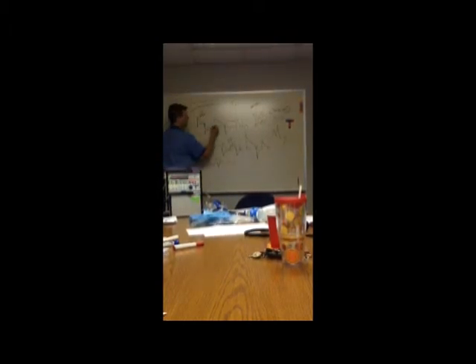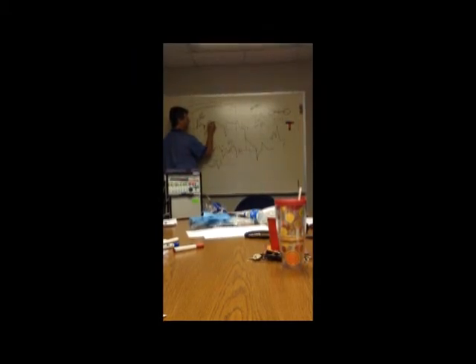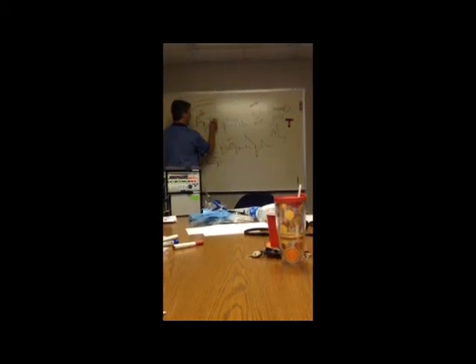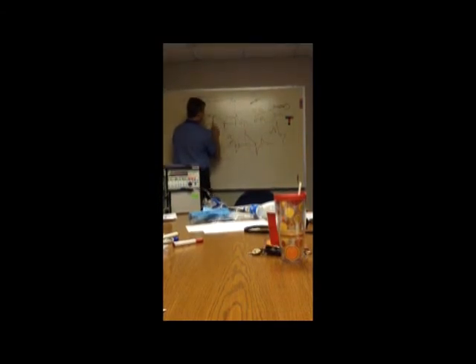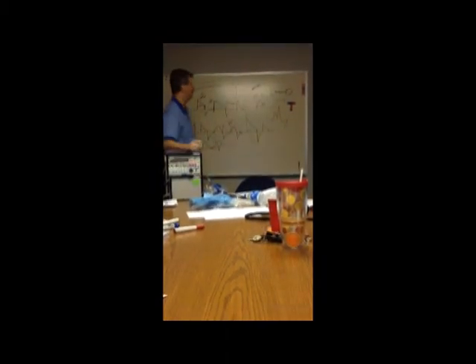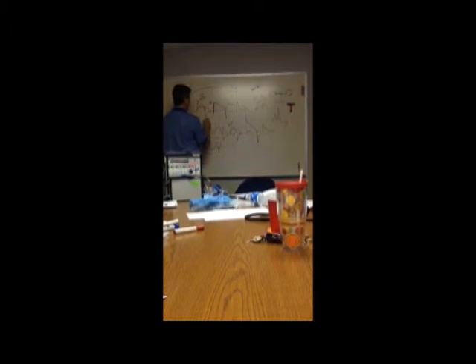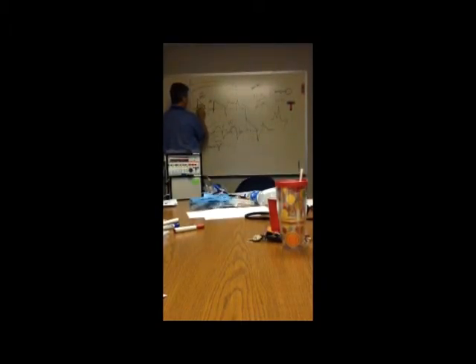All right, when this one starts, the machine says, I'm not going to give them 500 and start it and blow it for a minute and then let it out. I'm going to inflate their lungs to a set pressure. Say you set the inspiratory pressure at 25. The machine says, all right, breath time, inflate to 25, and immediately blow as hard as it can, which is important, as hard as it can until that pressure of 25 is reached. Once it reaches that pressure, your lungs are starting to open up or you're breathing in, so it has to maintain that pressure for the time you have set. Say you have it set at 1 second at a time.